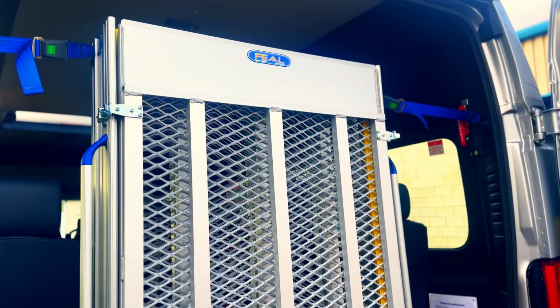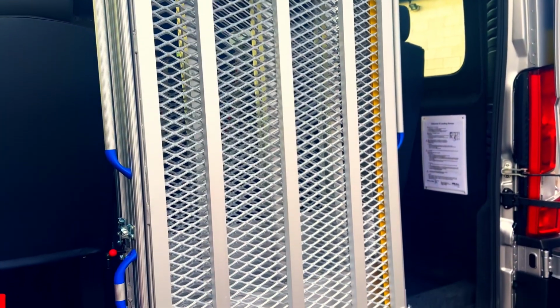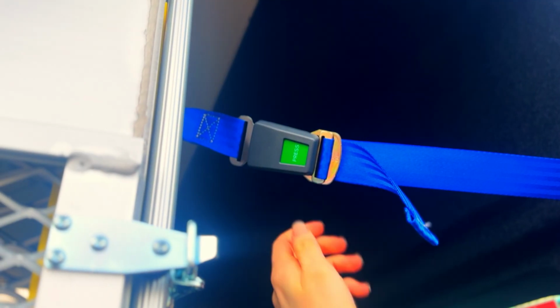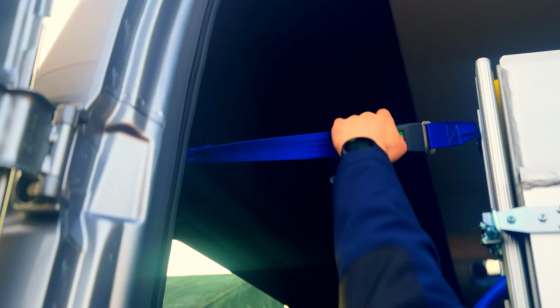How to use a 15-foot wheelchair ramp, a step-by-step guide from CVM World. Step 1. Start by unbuckling the straps that hold the ramp securely in place. Make sure they are fully released before moving on.